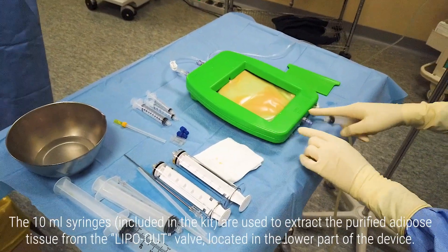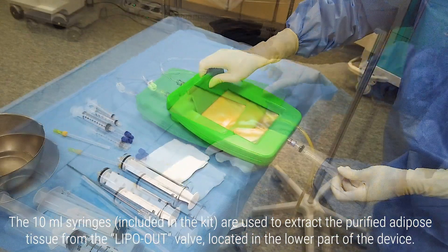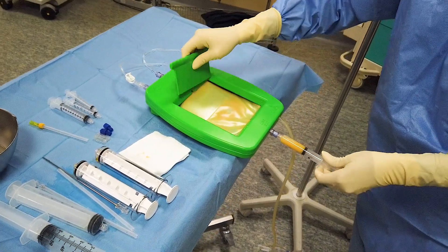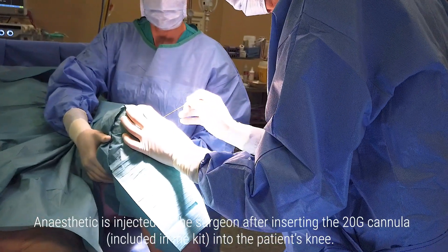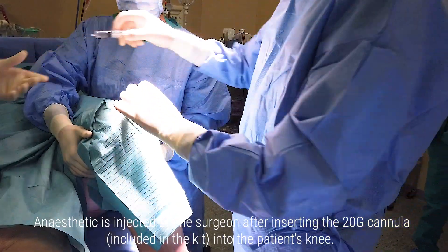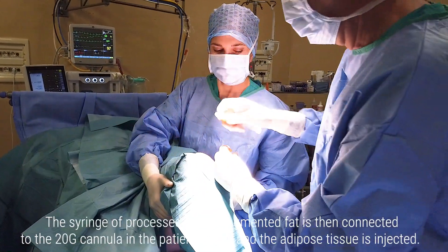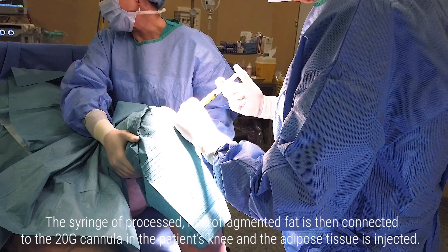The 10ml syringes included in the kit are used to extract the purified adipose tissue from the Lipo-out valve, located in the lower part of the device. An anaesthetic is injected by the surgeon after inserting the 20G cannula included in the kit into the patient's knee. The syringe of processed, micro-fragmented fat is then connected to the 20G cannula in the patient's knee, and the adipose tissue is injected.